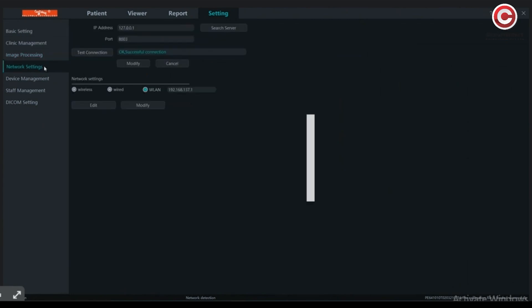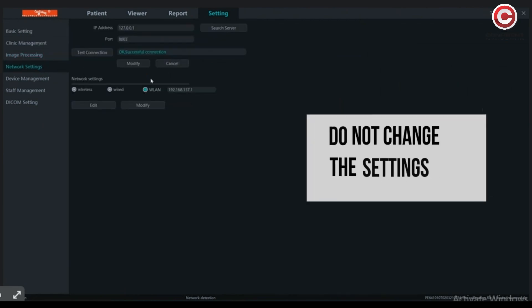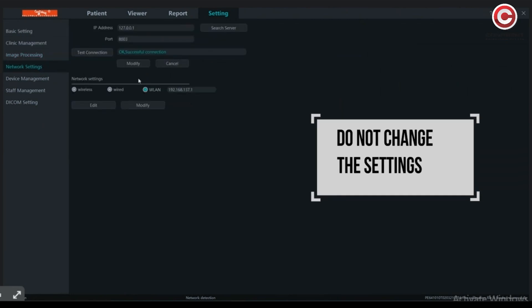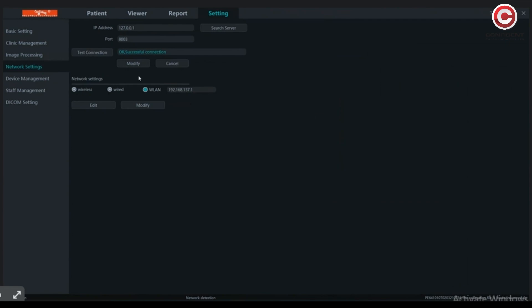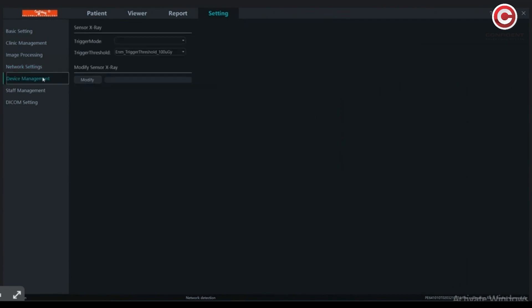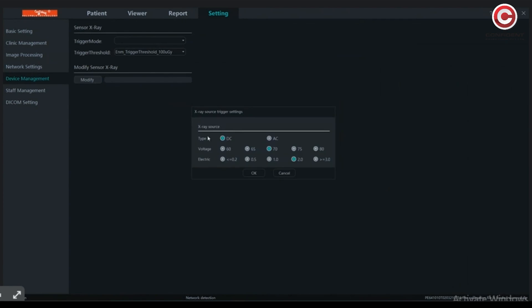Network settings will show default settings — do not change them. The details of the X-ray device are automatically taken when connected. If required, you can change the settings.